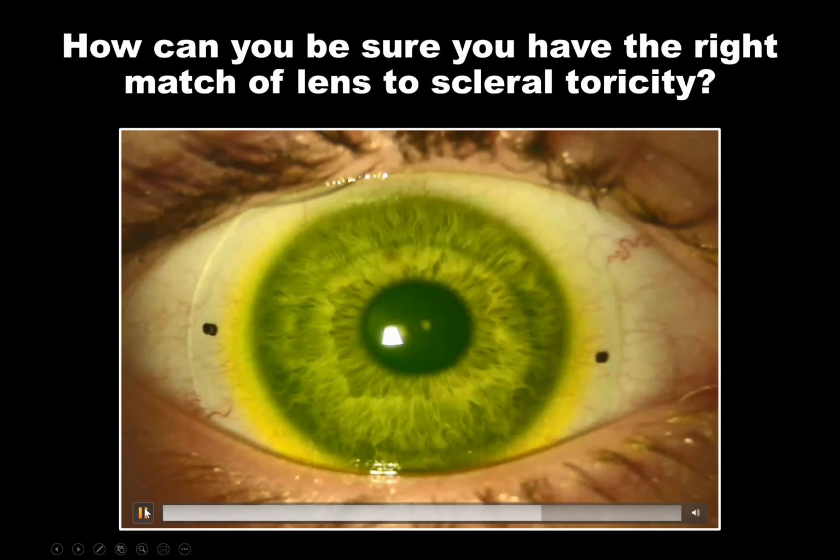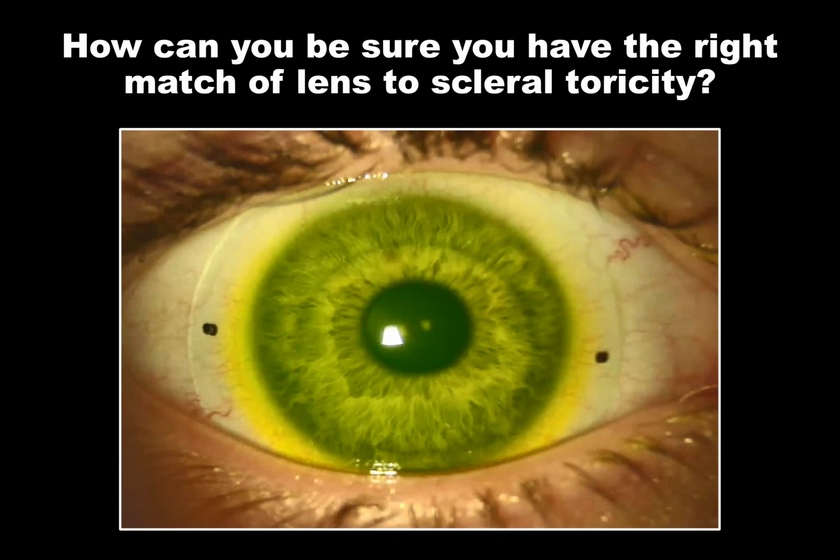I'm going to try to stop this video. If the fluorescein comes in at 12 and 6 o'clock, if you notice that it's leaking in underneath the alignment zone at 12 and 6, and this is the steep meridian, you know you need more toricity. The markers are the flat meridian of the eye. The opposing unmarked axis is the steep meridian. So if fluid is coming in here, that means that the lens doesn't have enough toricity, and that may be why it's rotating on eye. That may be why you can move it off axis and it doesn't want to come back to any similar point.